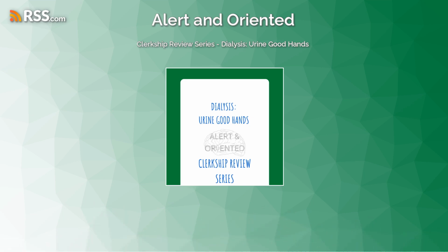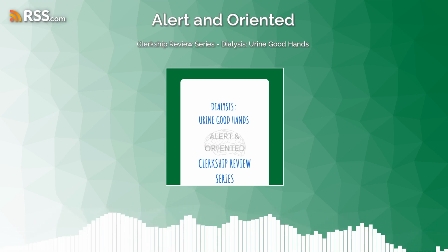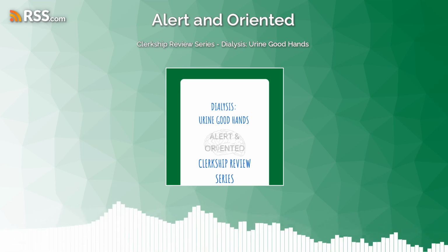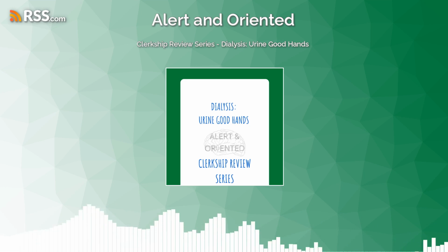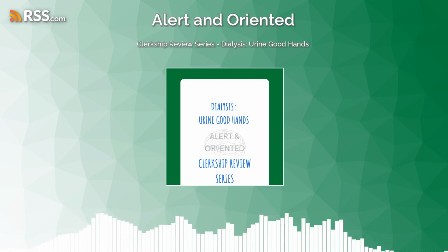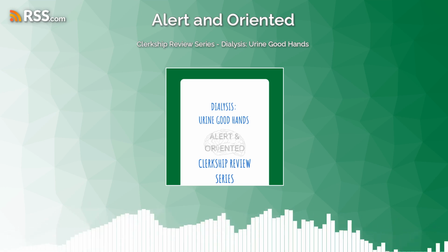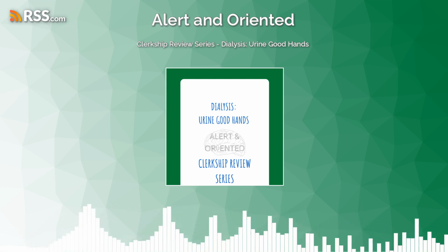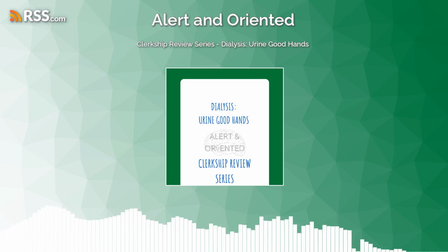All right. So we've talked about continuous therapy. We've talked about intermittent therapy. We've talked about a hybrid model, which is somewhere in between. And we've also talked about whether we use diffusion or convection. There's also another terminology that comes up in discussion of dialysis, and that's called ultrafiltration. Ultrafiltration refers to removal of fluid. And essentially that fluid is plasma water.